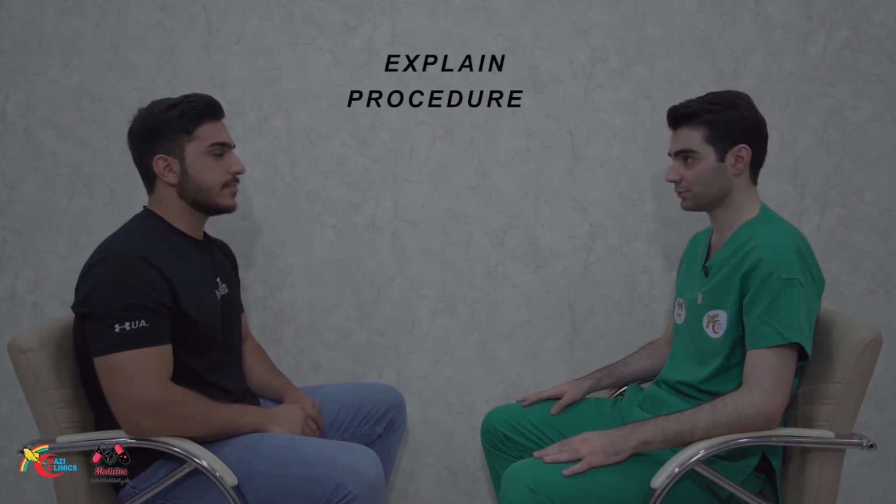Okay, to do an ECG for you, which is an electrical trace of your heart, it involves some sticky pads on your chest, legs, and arms. It will measure electrical activity of your heart. And I need to take your top off. Will that be okay with you?